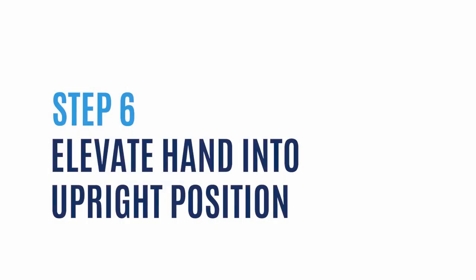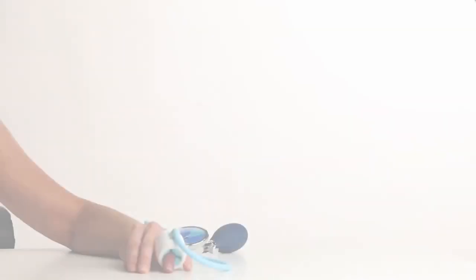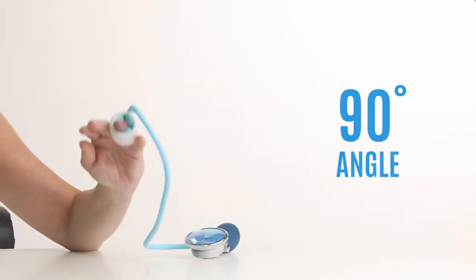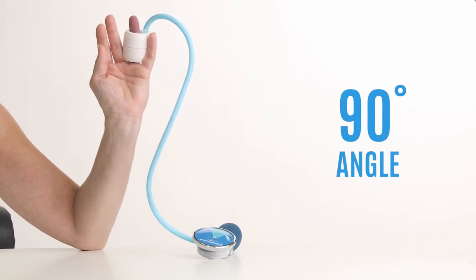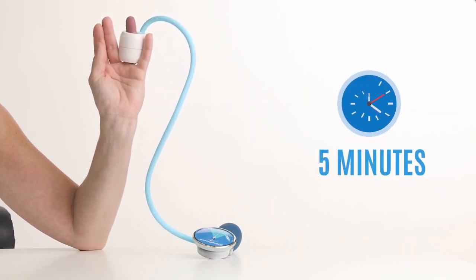Step 6: Elevate the hand into the upright position. Have the person elevate their hand to a 90 degree angle with their elbow resting on the table. Keep the hand elevated for a minimum of 5 minutes.